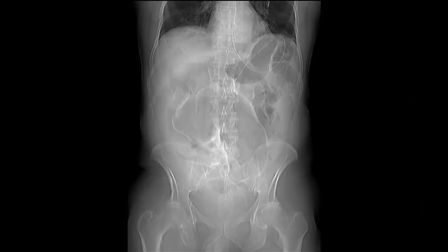Here we have a scout view — a topogram from a CT scan of the abdomen — showing this dilated loop of colon within the central abdomen, and the vector is pointing up towards the left upper quadrant. That, combined with the fact that you're seeing dilated small bowel loops proximal to this dilated colonic loop, tells you that we're dealing with a cecal volvulus.